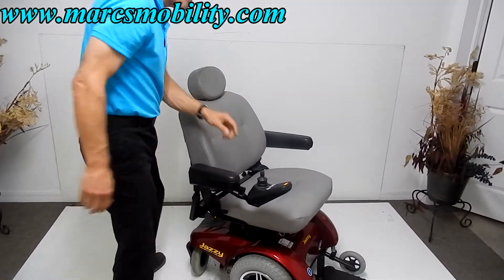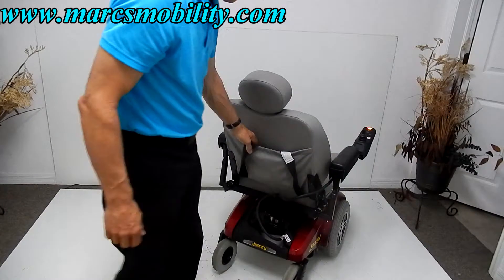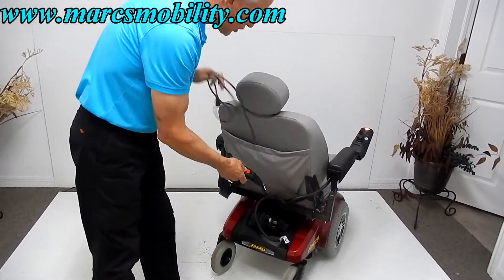In the back there's also a safety belt, and you've got your charging cord as well.